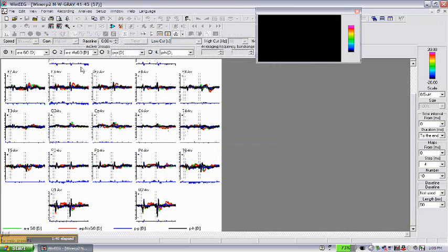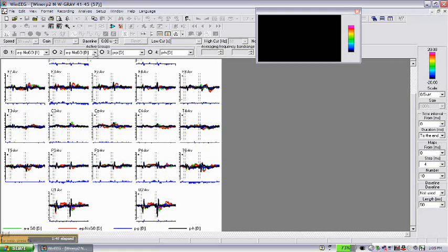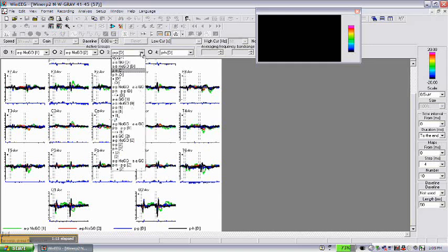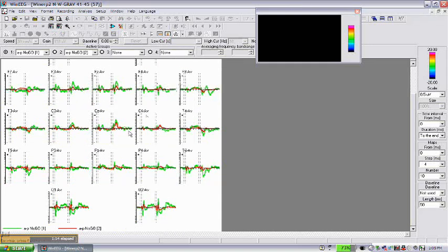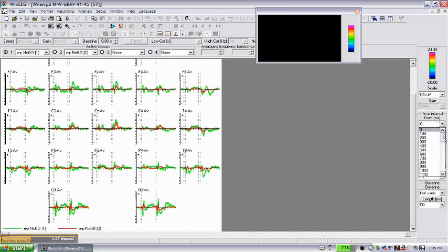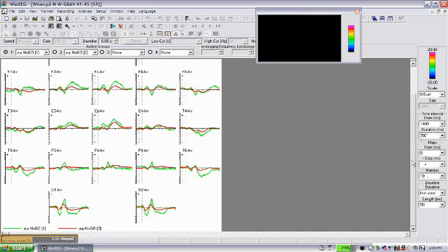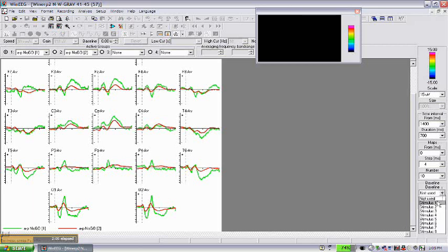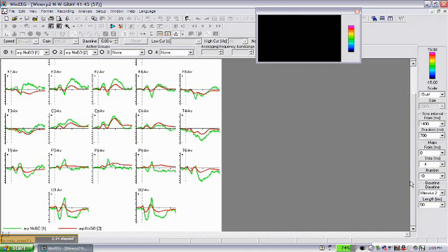Then we can compare ERPs for, say, no-go condition in this patient, no-go condition in the normative database. In this window, green is the patient ERPs, red is normative data, and these are results of comparison. The normative data and the subject data are superimposed on each other. In this case, you can hardly say anything.